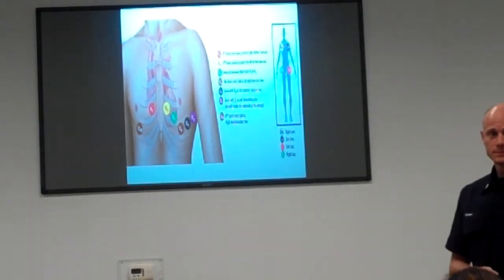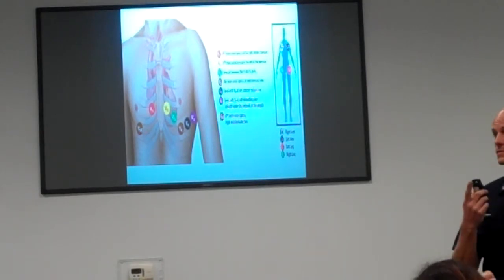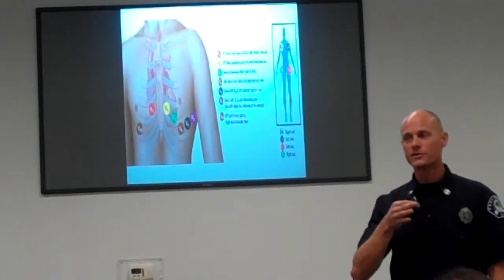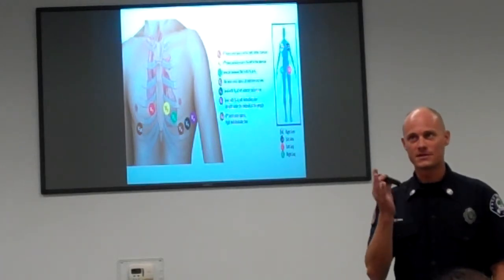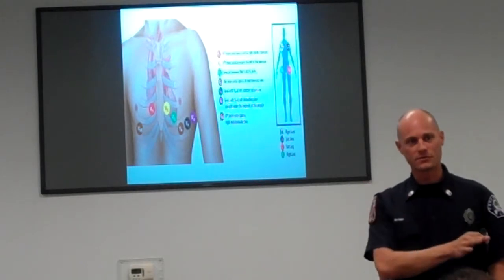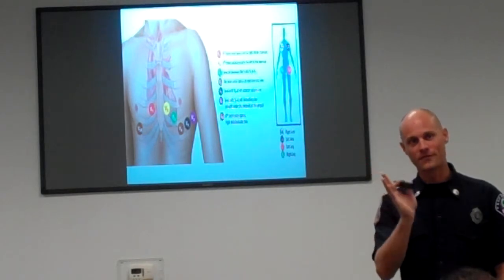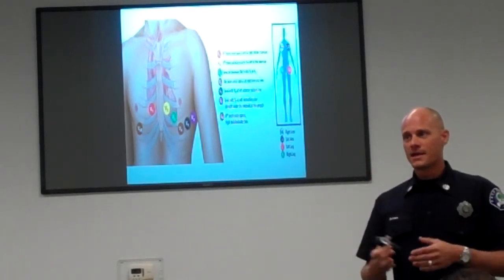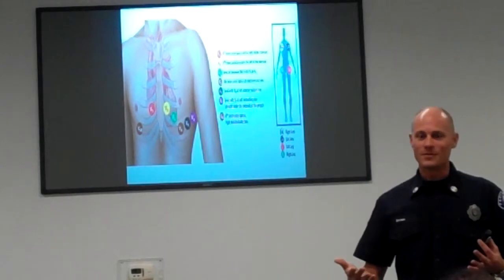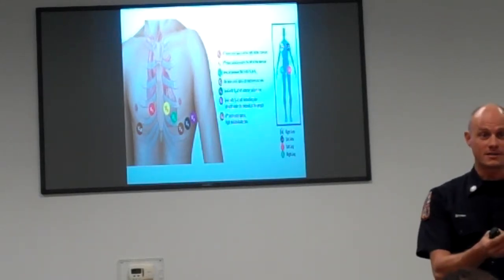How do you typically try to position the patient when you're doing your 12-lead stuff? You like to have them, more or less, at a 45-degree angle, lay them down if they can tolerate it? Correct. Yeah, exactly. So what they say is when you're doing serial 12 leads, always have them in the same position. We know that's not always possible, right? For serial 12 leads, the best position is supine. Second best position is a 45-degree angle. When we do serials, just try to keep it the same if we can. Supine is best, I guess, is the short answer.